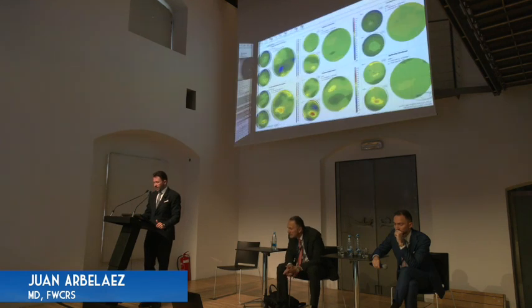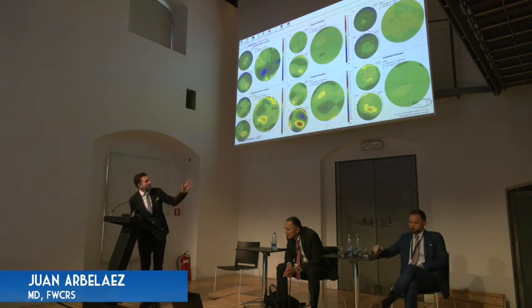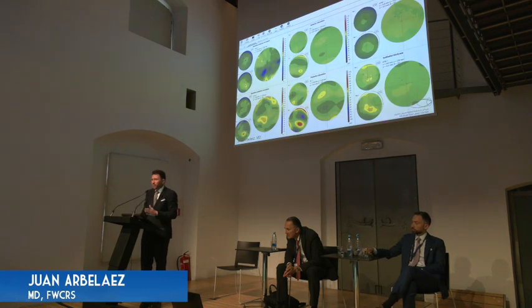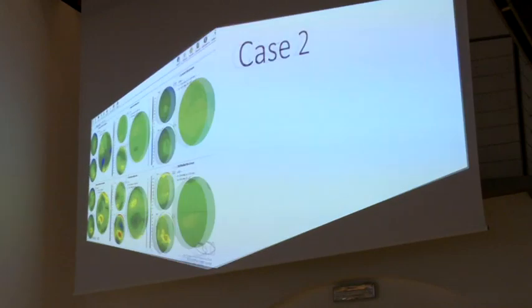Here we have another excellent tool, that is the enantiomorphism, that basically shows the right and the left eye in a mirror image to see all the maps and see the location. It's basically in a mirror, but in this case, because the keratoconus is different degrees, one more advanced than the other one, we can see the difference between one eye and the other one.